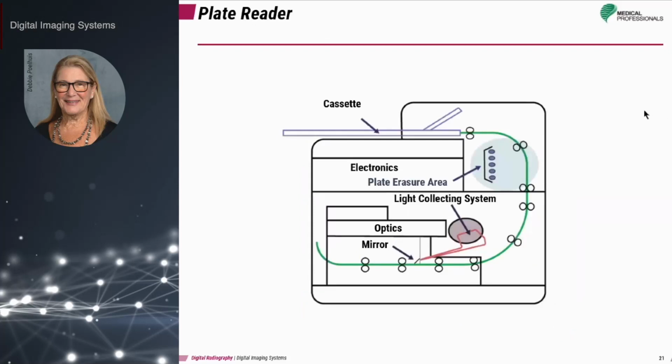So here's an image of a plate reader showing where the cassette is placed as it opens up and the imaging plate comes out and follows along the system. The design of the plate reader varies by vendor, but they all have the same components. The drive mechanism along here moves the plate through the scanning process.